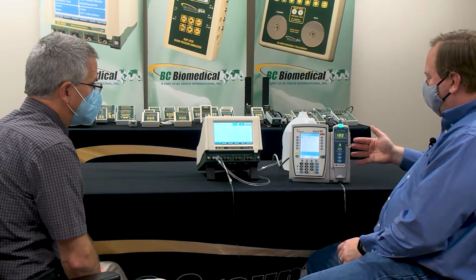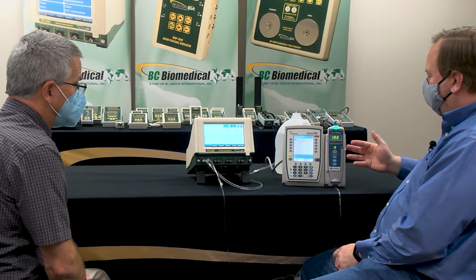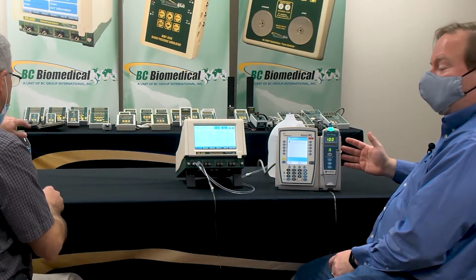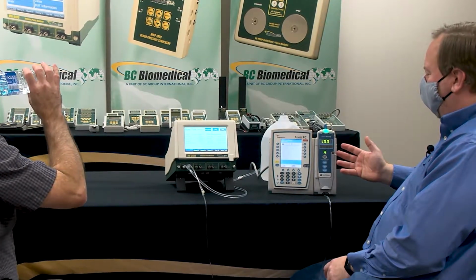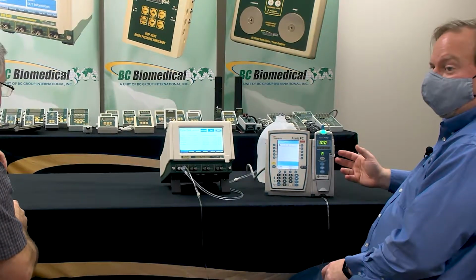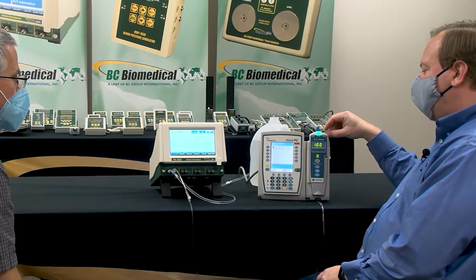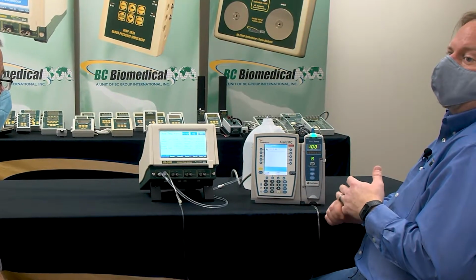So why does that thing fluctuate so much on that instant? You know, it's been 75 and 117. It's crazy, isn't it? So if you listen, there's fingers in here, right? There's a motor that's doing something like this to push the water down. And it has to reset and get back to the top. And then it does this, and then it has to reset. So when it does that, it's pausing. So there are very few infusion pumps that have a true continuous flow rate. Like a roller type of.